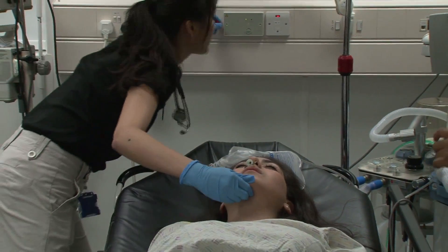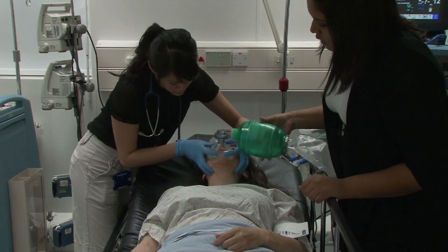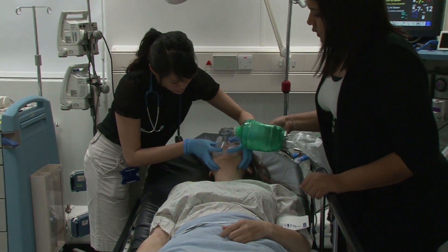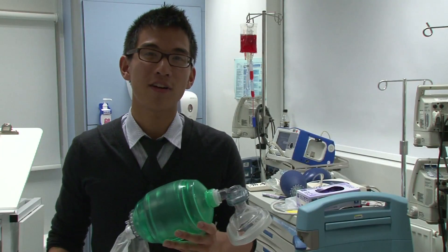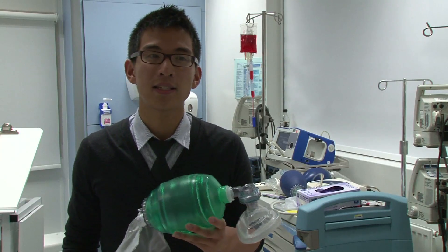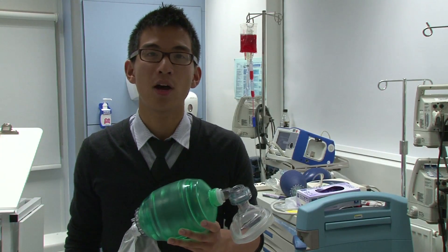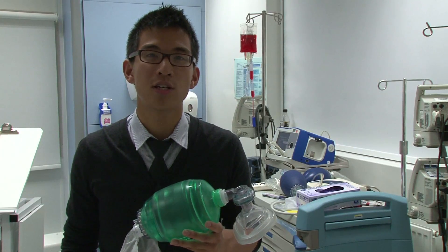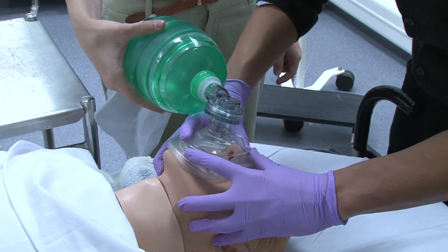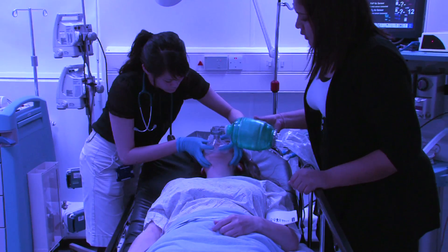She's not breathing but there's a faint pulse. Can you pass me the bag valve mask? Can you call 2222 and bring the crash cart? This is the bag valve mask, the most common device used to ventilate patients not breathing or breathing inadequately. It is a self-inflating bag with a one-way valve and can be connected to a face mask, an LMA, or an endotracheal tube. On its own, the bag valve system ventilates patients on room air only, but can be connected to an oxygen supply for higher concentrations of oxygen. You should form a seal around the nose and mouth by performing a jaw thrust with your middle, ring, and little fingers, and pressing down on the mask with your thumbs and index fingers. An assistant should squeeze the bag for you. Continue ventilating the patient and reassessing for signs of life until help arrives.